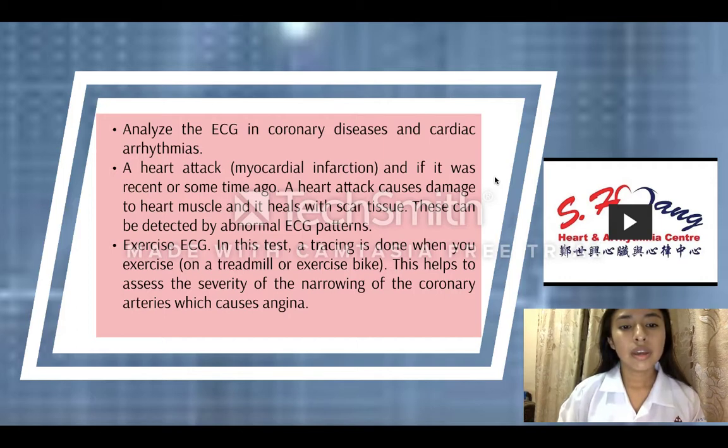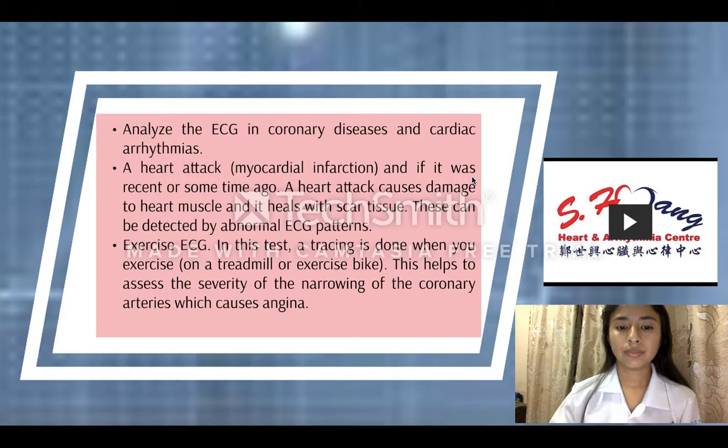Exercise ECG. In this test, a tracing is done when you exercise on a treadmill or exercise bike. This helps to assess the severity of the narrowing of the coronary arteries which causes angina.